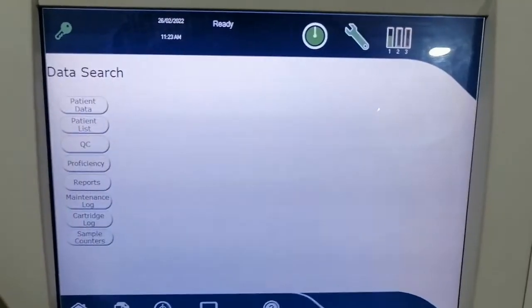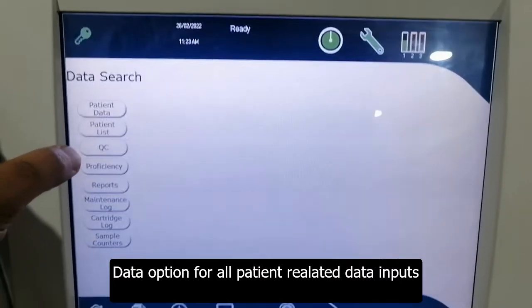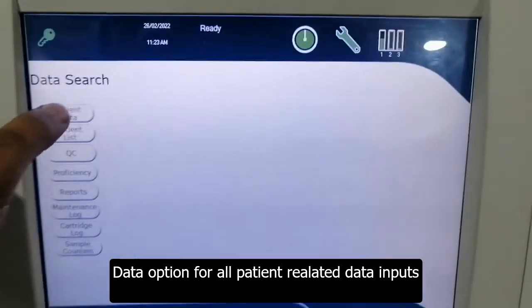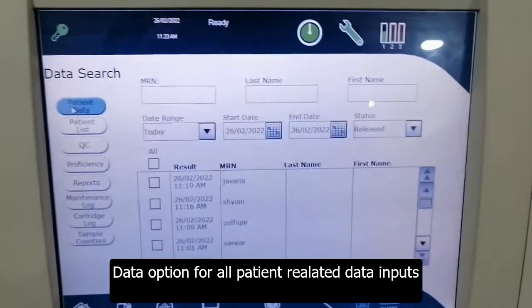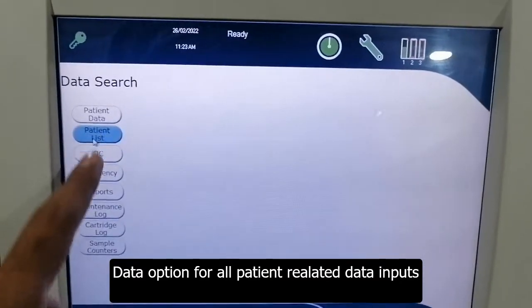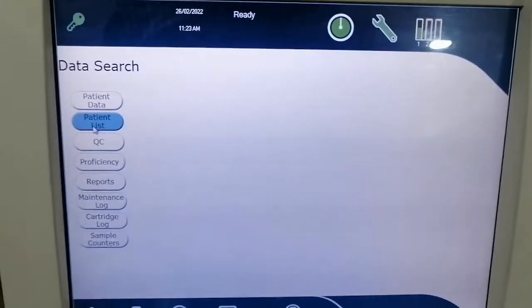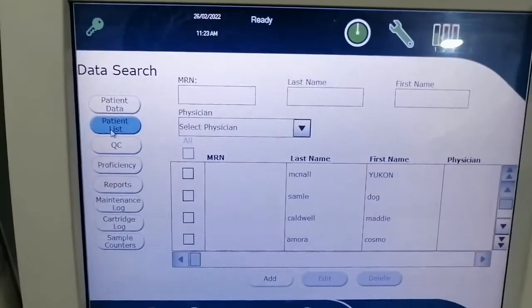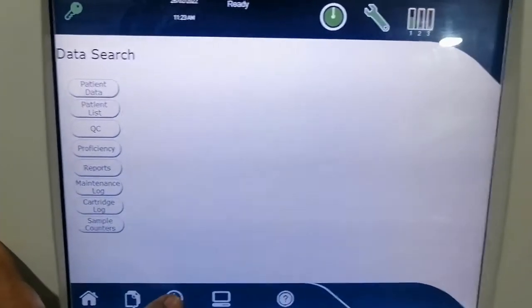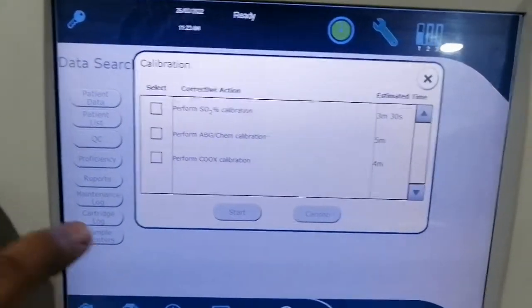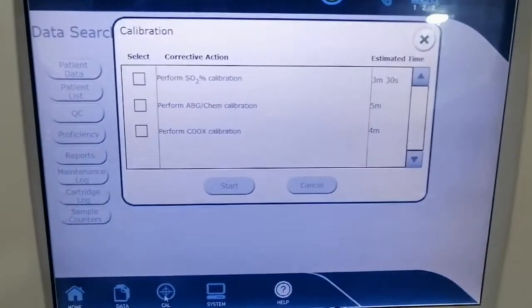This is the data menu where you can enter patient data, access the patient list, and run quality control. Here is the patient data list of previously performed tests, quality control, and other parameters. This is the calibration menu where you can perform calibration of different parameters as required.